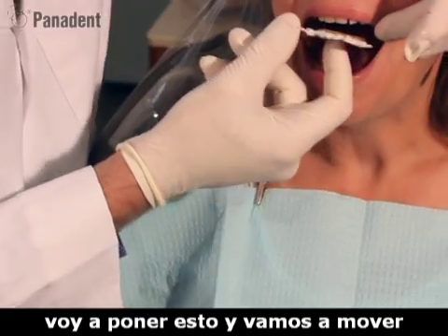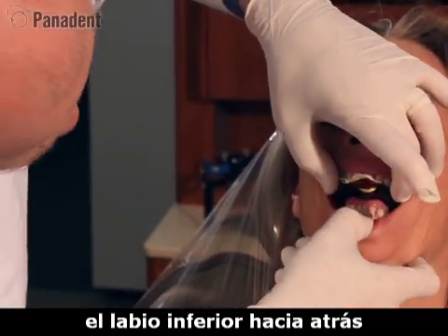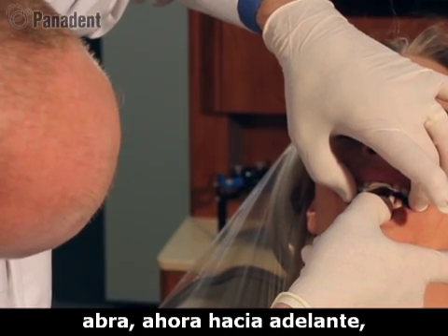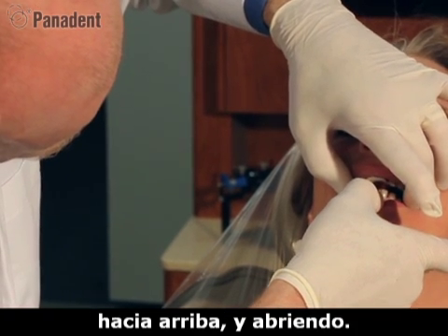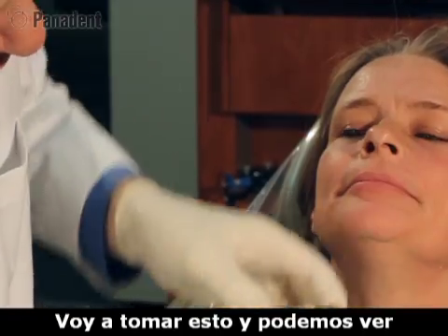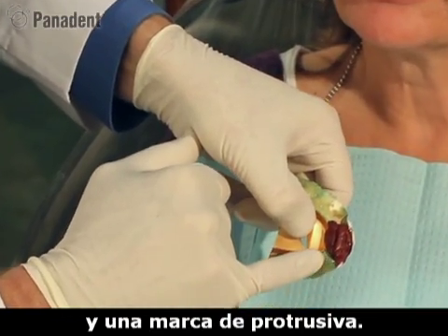I'm going to place this in. I'm going to roll the lower lip back again. Back with the jaw, up, slowly, up, stop, open. Now come forward, slide forward, up, and open. I'll take this out. And we can see we have both a centric index and a protrusive index.